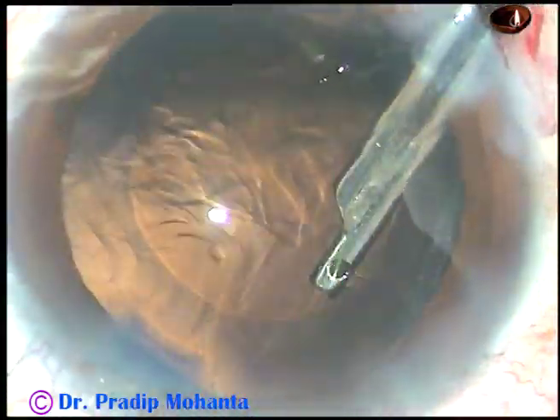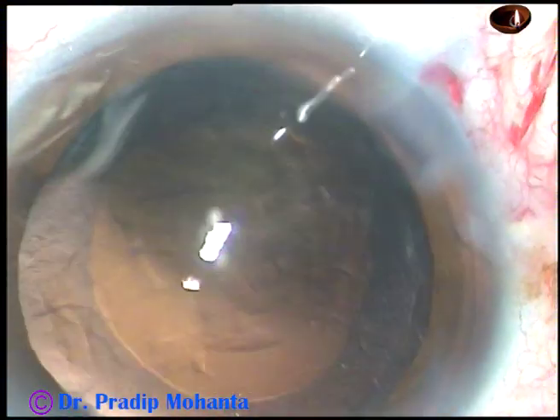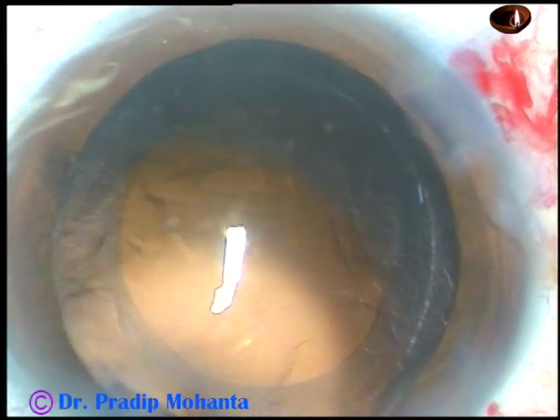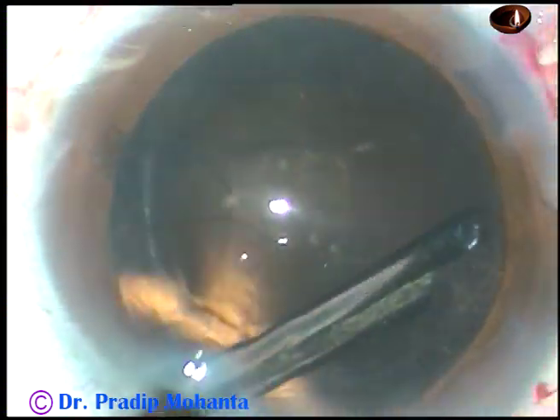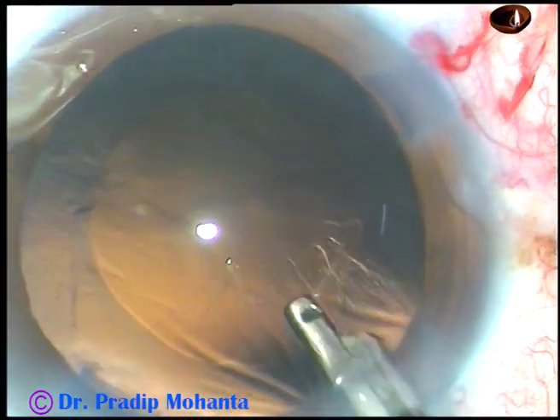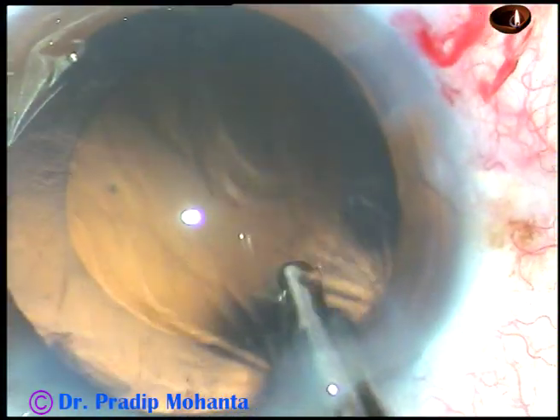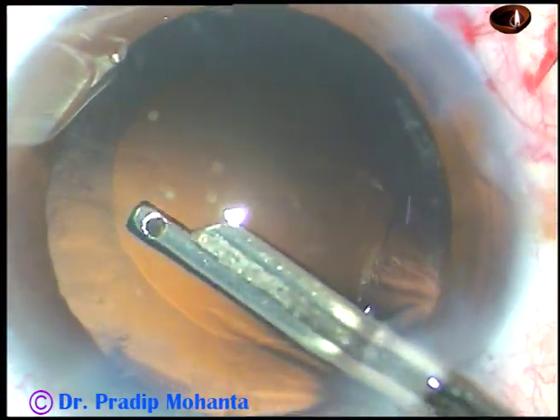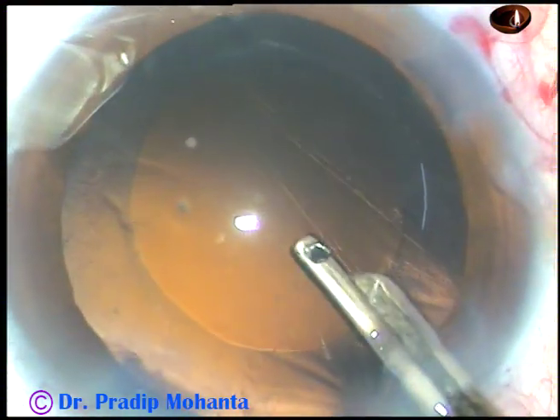Yes, it is coming off nicely now. With the Simcoe, you can control the vacuum more efficiently. With bimanual irrigation aspiration, the control of vacuum is not so efficient in my hands. It is a much safer instrument than bimanual irrigation aspiration.